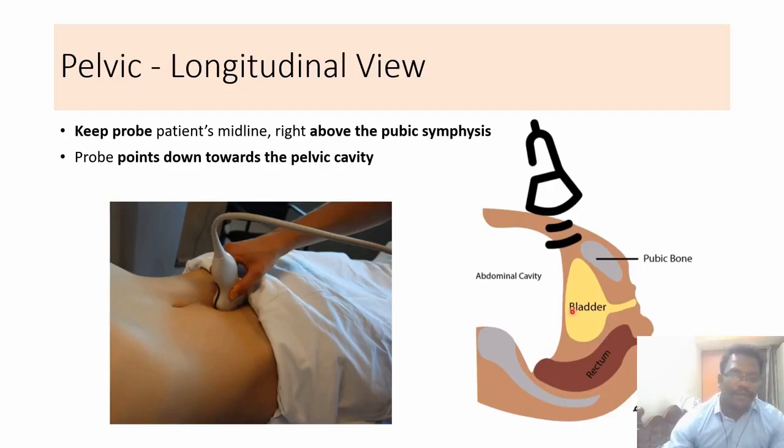Third thing we need to remember is it is normal to have very minimal or some amount of physiological fluid in the rectouterine pouch or pouch of Douglas in females.